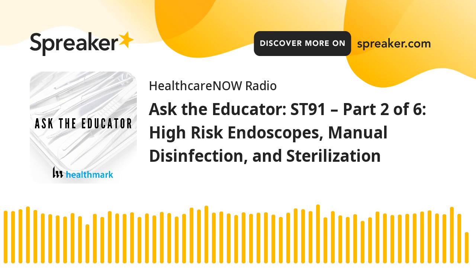And when we think about what we do to not have to do manual disinfection, what I recommend first is that we have an inventory of our scopes. You're already supposed to have an inventory of all the scope models that you have and their serial numbers. Now you're going to want to take that list and further designate which of those are high risk, as we talked about just a couple minutes ago, so that you know those are under that designation, and we have to do different things with them as far as cleaning verification goes.